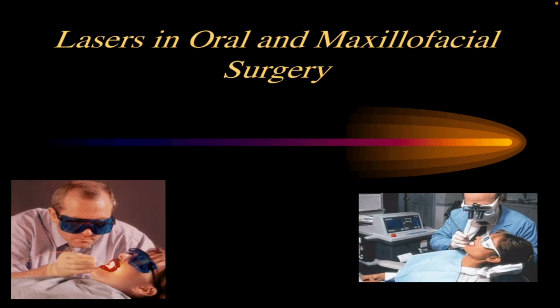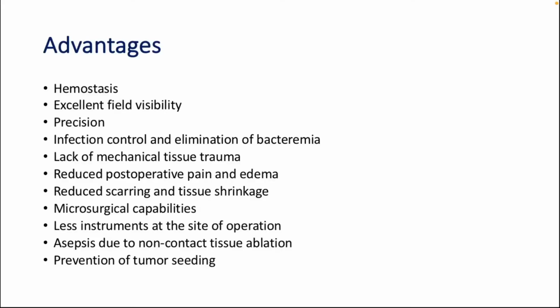Electrocautery or high frequency devices as well have been replaced with laser. As for the advantages of laser in oral maxillofacial surgery, laser has an excellent hemostasis effect because of its high energy and thermal status that will enable it to clot or coagulate the blood vessels as soon as it hits them. Laser, due to its small size, provides excellent field visibility and precision, and infection control due to non-contact operation.